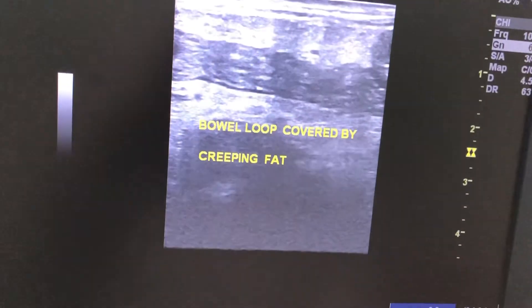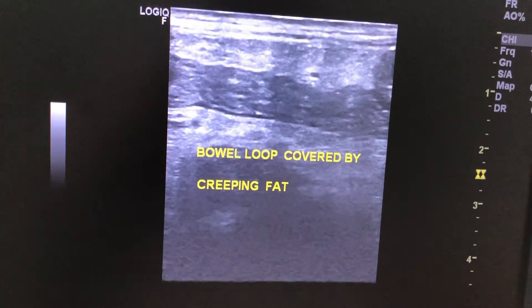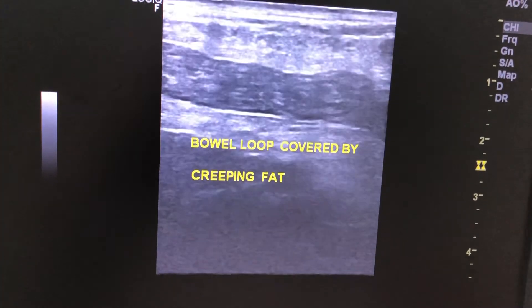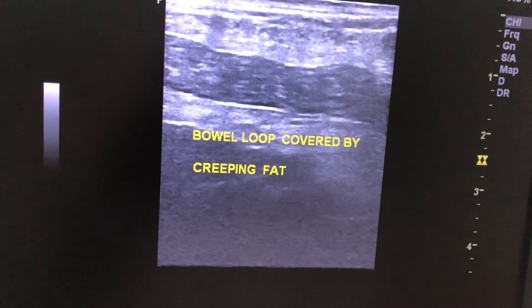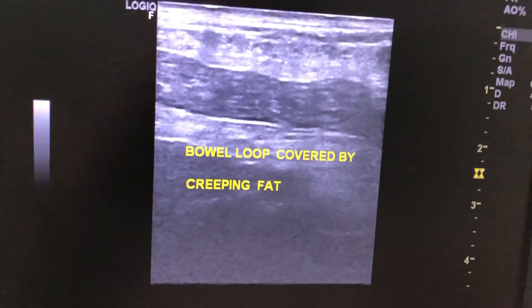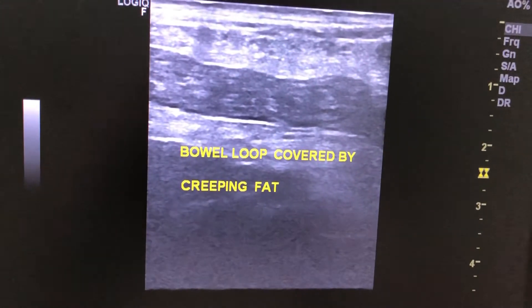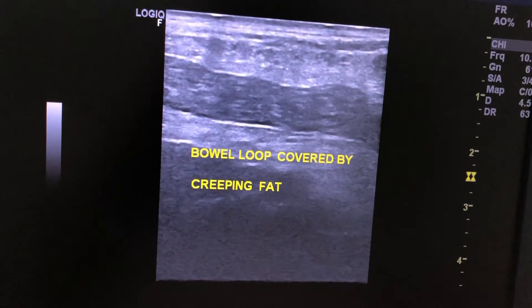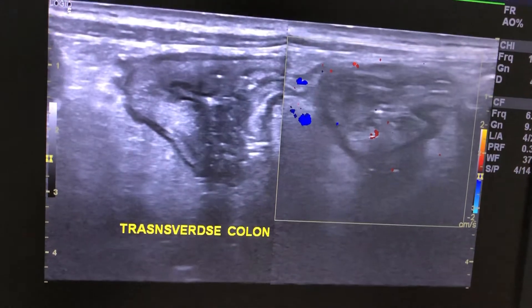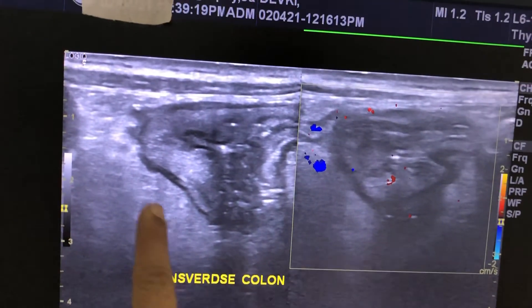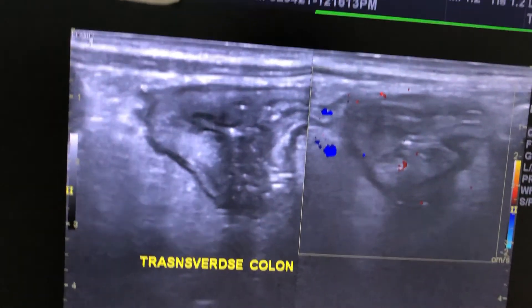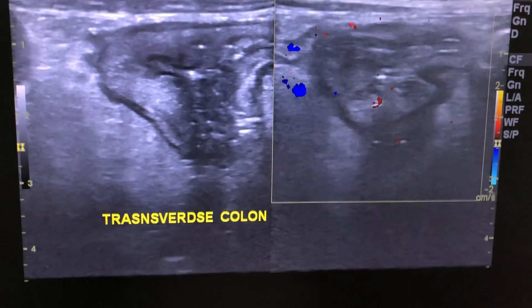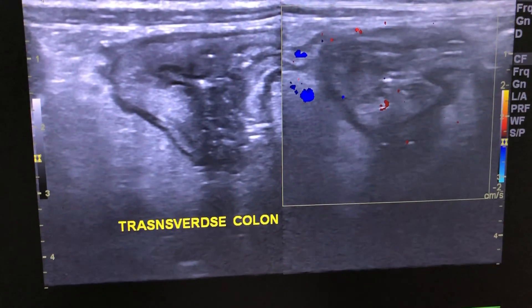This is a bowel loop covered with echogenic fat.